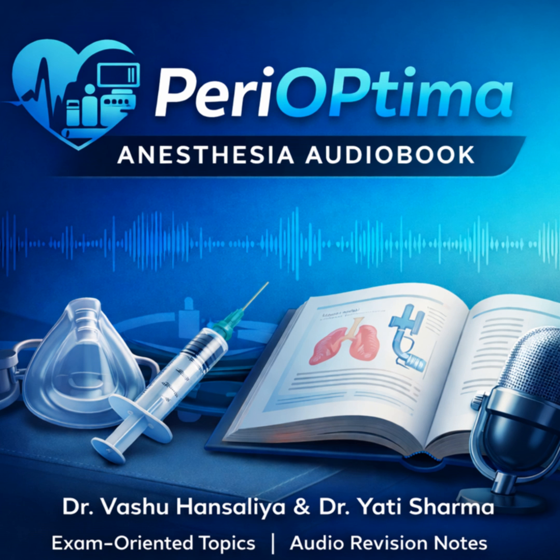And the fix. Management is immediate correction, adjustment, or removal and reinsertion, possibly with a different size or even a different device. Are there any specific, less common complications we should be ready to talk about? Yes. Laryngospasm can be triggered by inadequate anesthesia depth, or irritation of the laryngeal structures by the device itself. Uvular trauma has been reported, usually associated with a forceful insertion. And lastly, certain SGADs with large proximal cuffs, like the laryngeal tube series, have been linked to tongue engorgement.